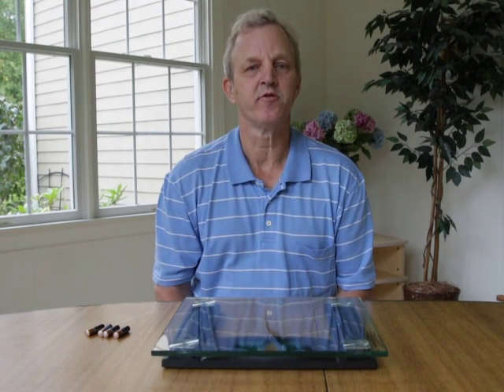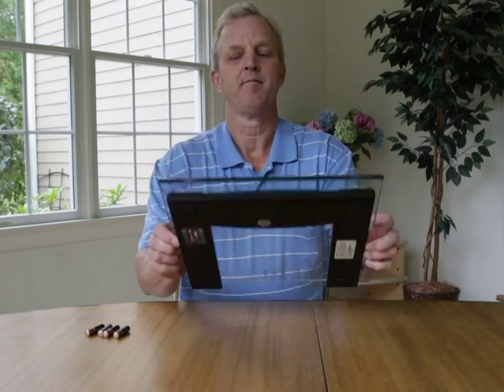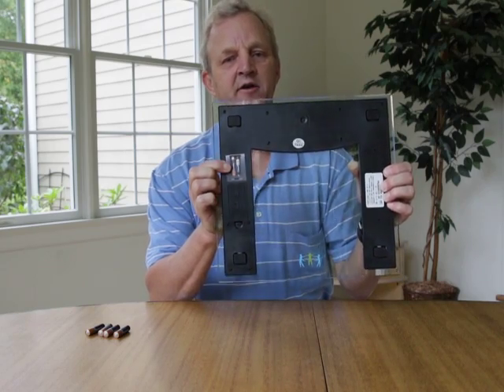I'm going to demonstrate how to install the batteries in the AmbioHealth scale. You can refer to the picture above the battery compartment for the proper orientation of the batteries.